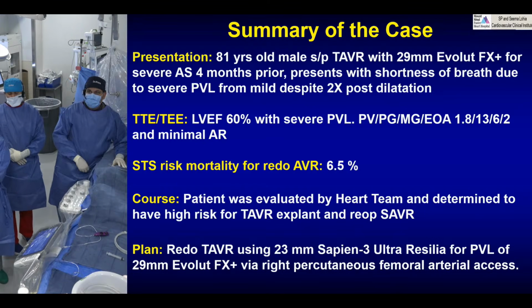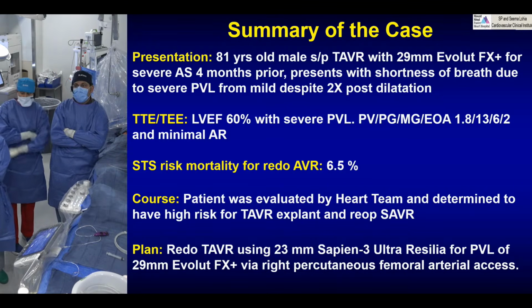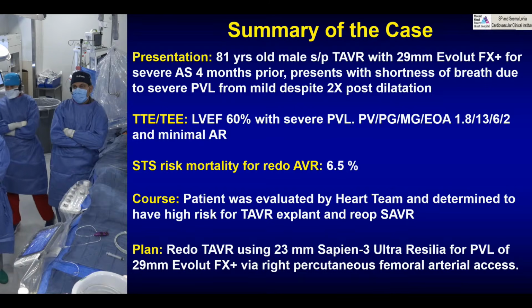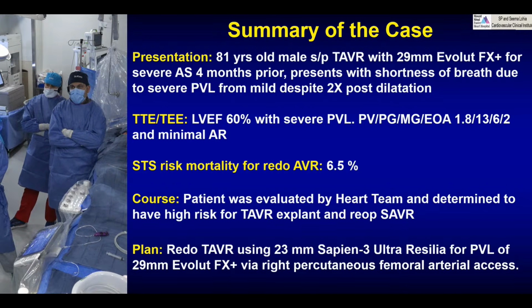The jury is divided. I could go either way here. Initially we were thinking 23, but today we're deciding 26. Well, we're still deciding. That's why we want to let the audience know: if it's a prosthetic stenosis here, there's no question it's going to be a 23 plus. But this is paravalvular leak.